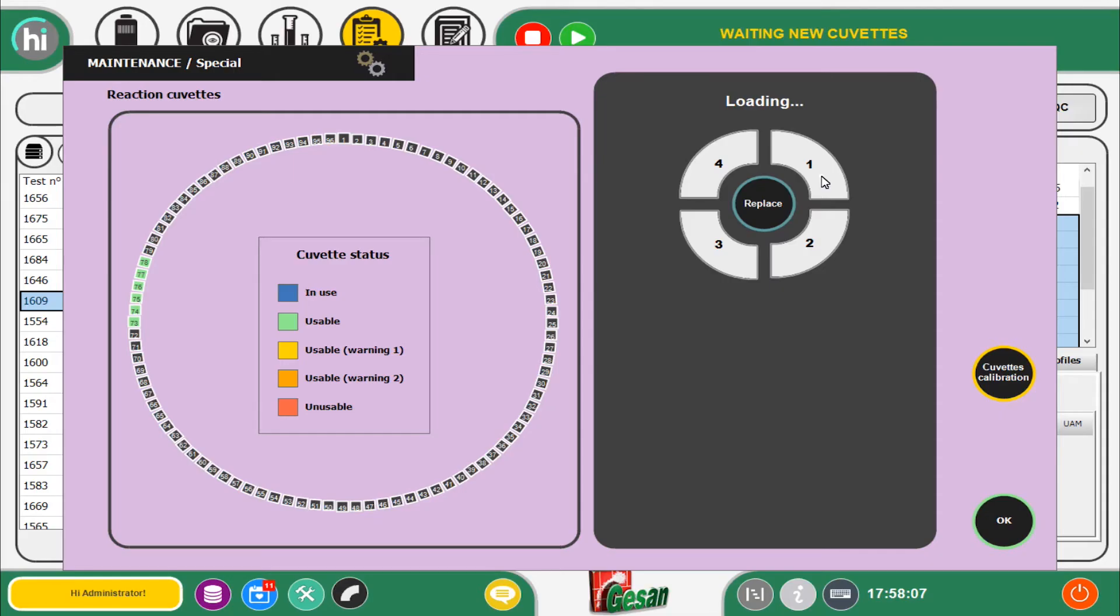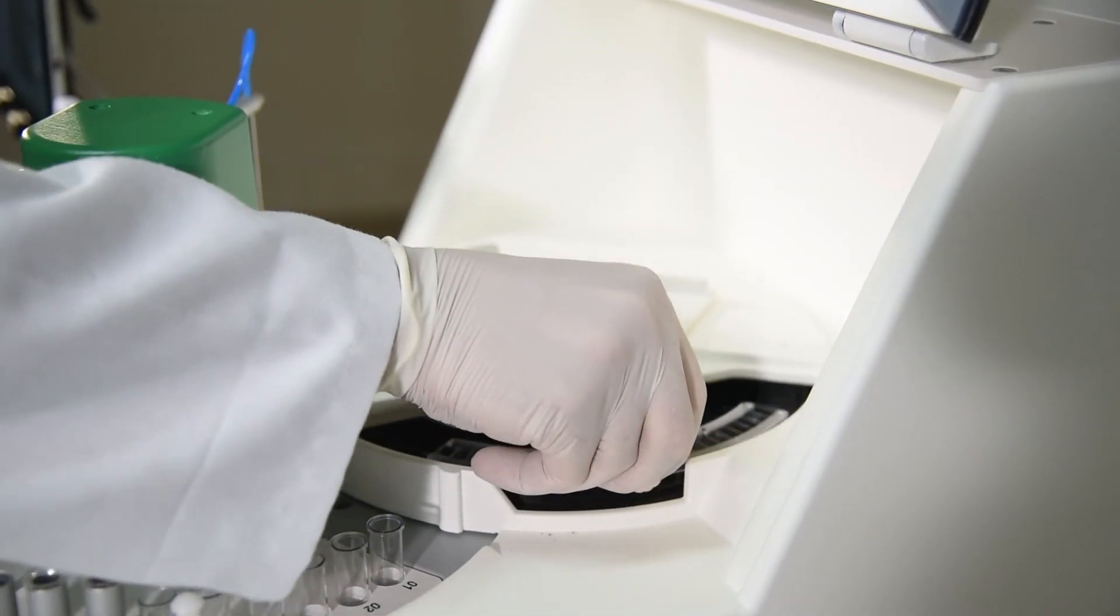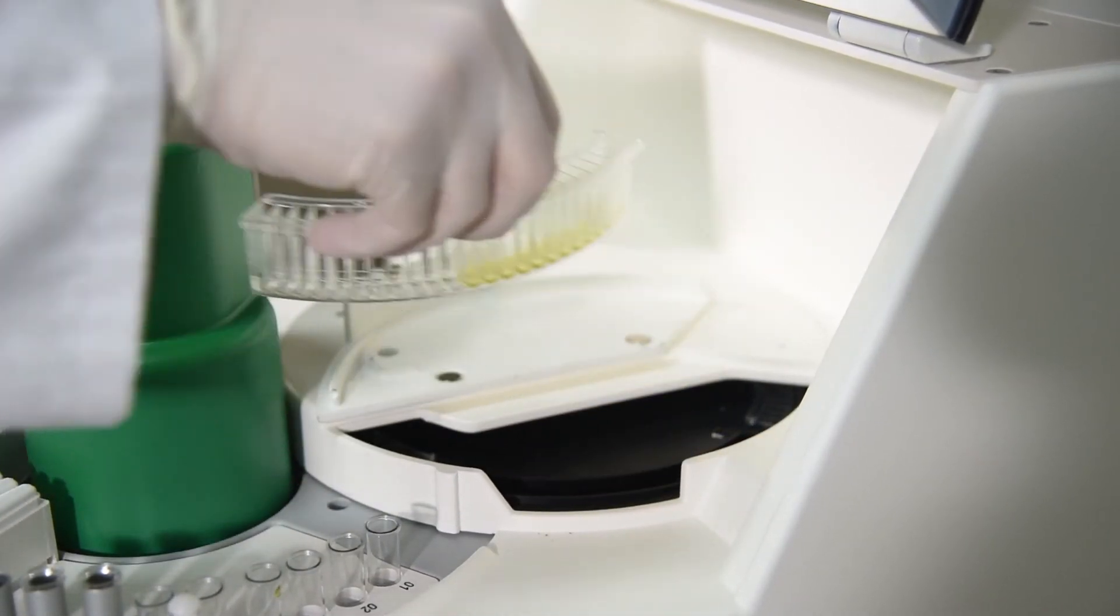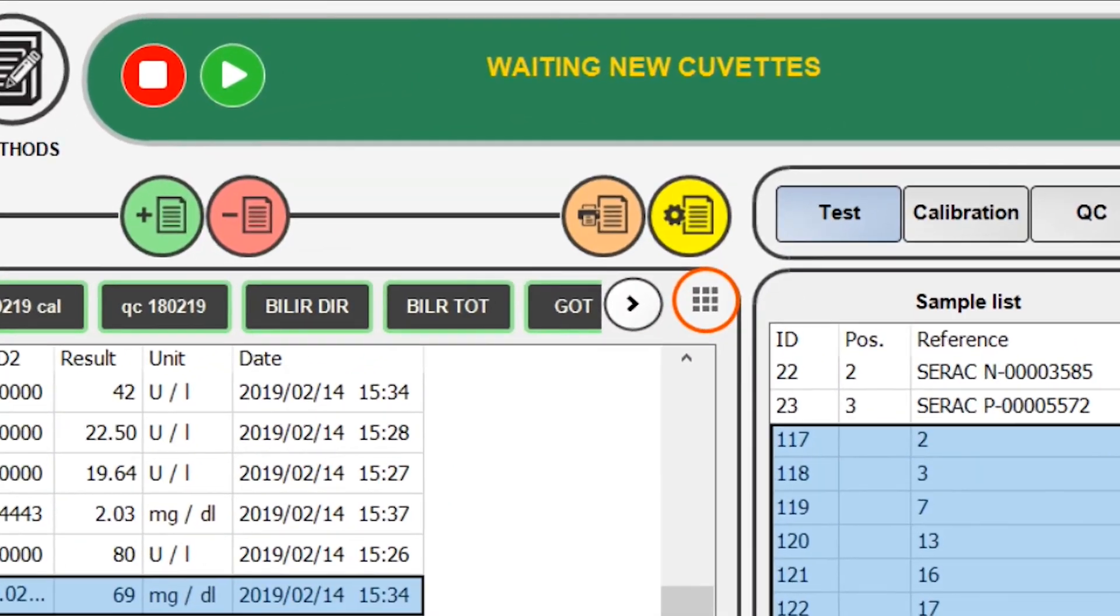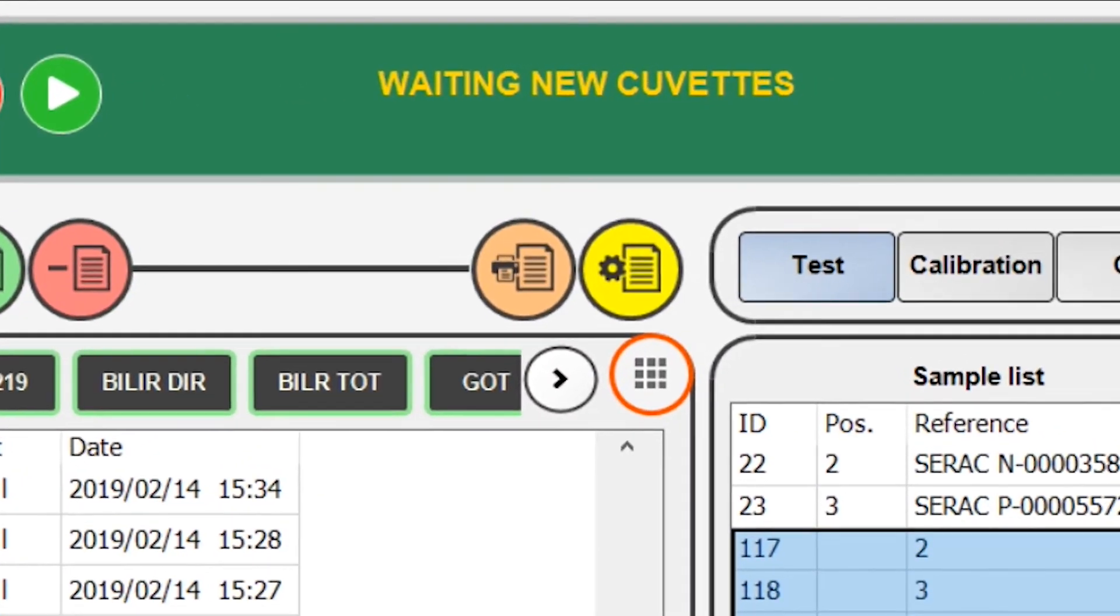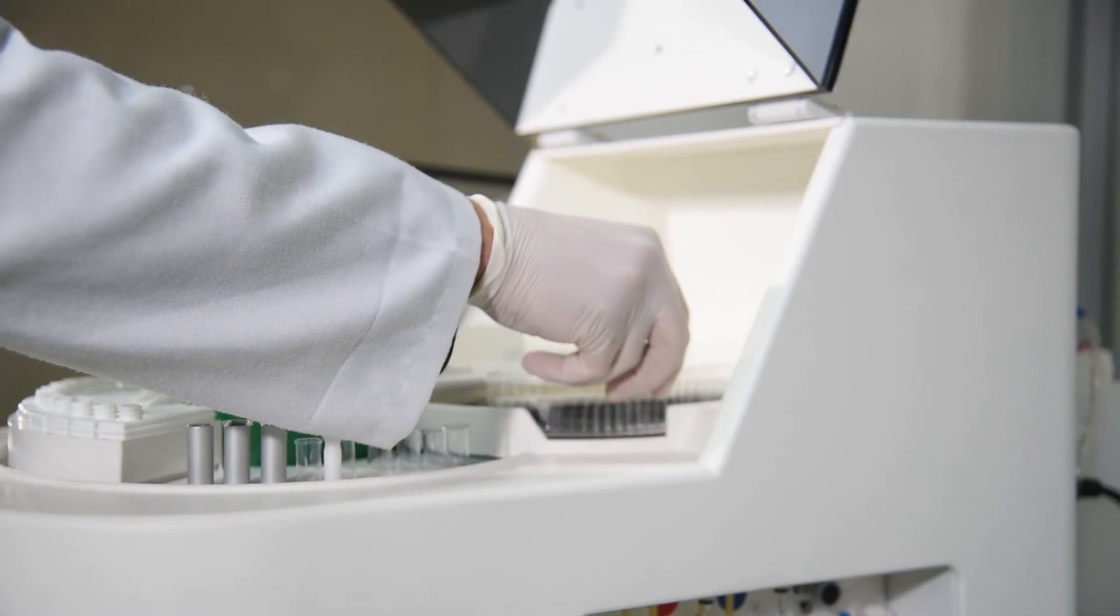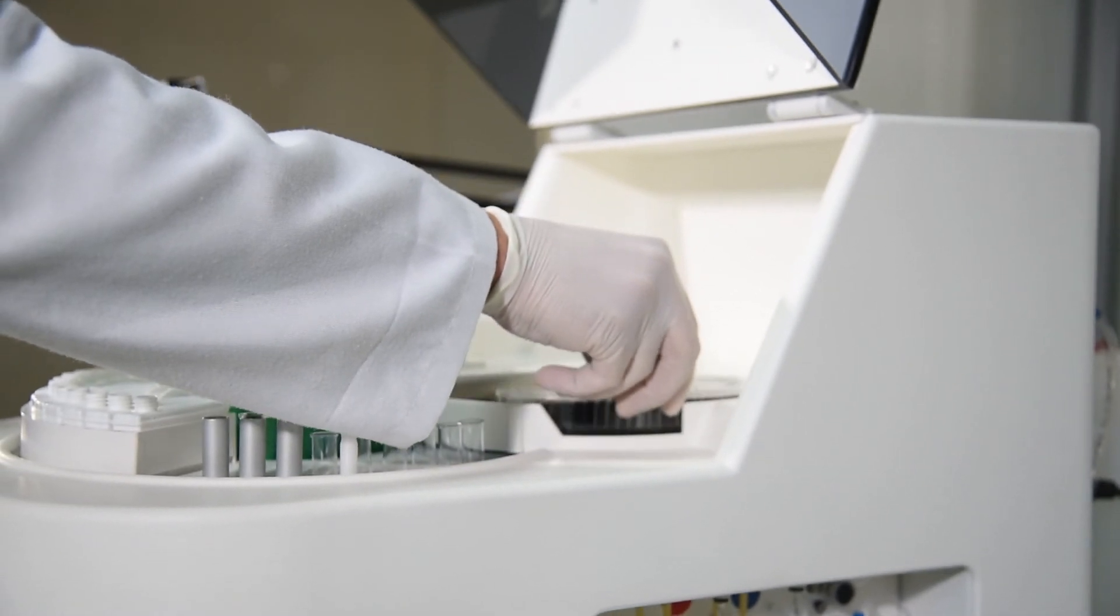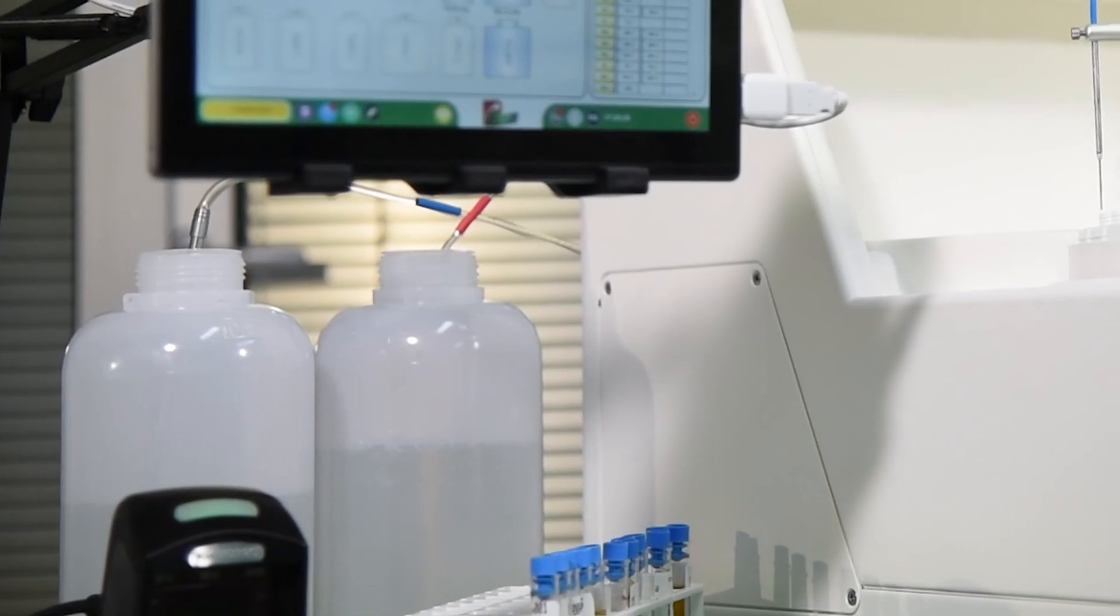The software manages the work in progress, making the most of the reaction cuvettes still available, going into forced pause only having used all of them and allowing the operator to replace the sectors.